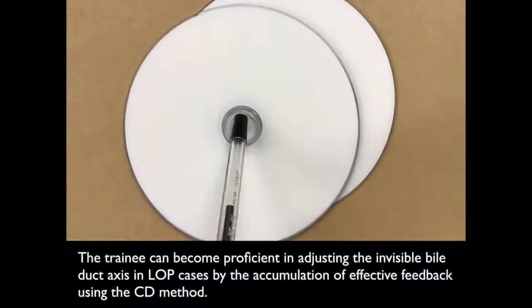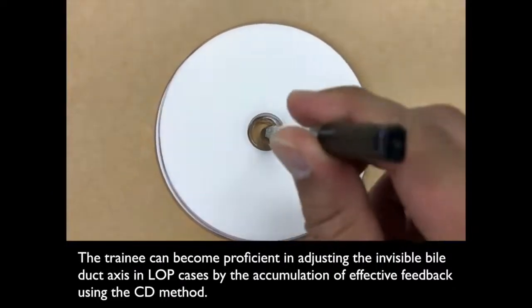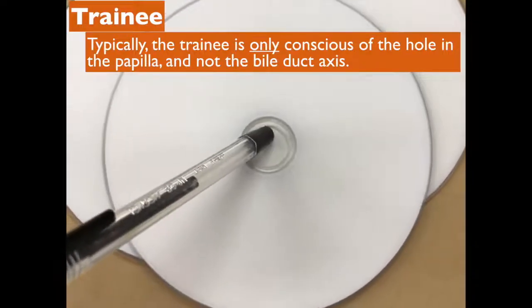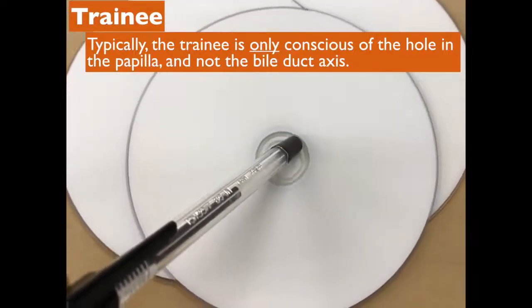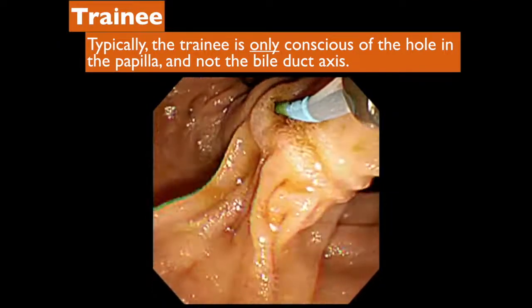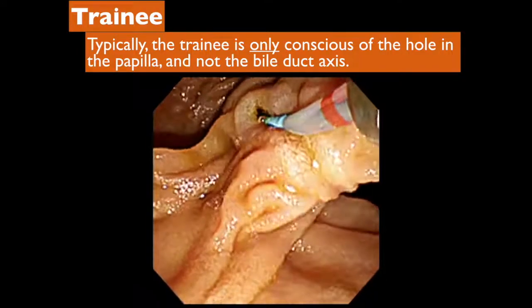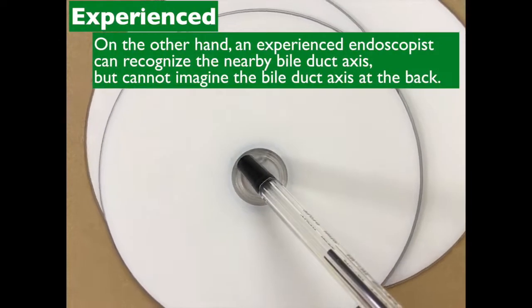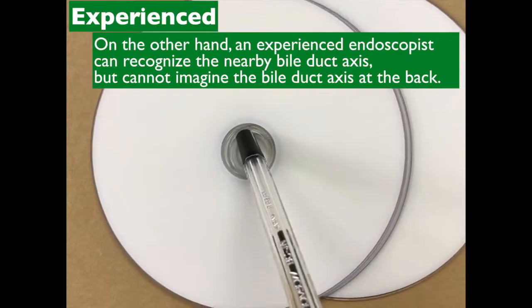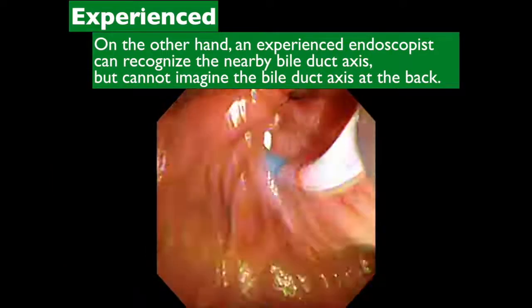The trainee can become proficient in adjusting the invisible bile duct axis in LOP cases by the accumulation of effective feedback using the CD method. Typically, the trainee is only conscious of the hole in the papilla and not the bile duct axis. On the other hand, an experienced endoscopist can recognize the nearby bile duct axis, but cannot imagine the bile duct axis at the back.